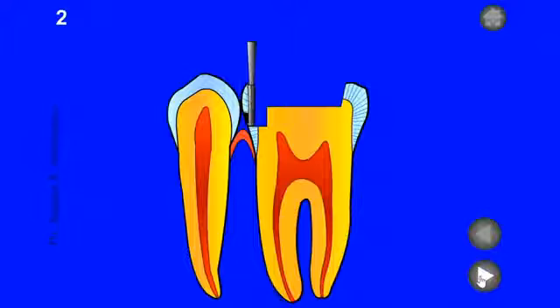Step 3. Remove all the remaining tooth structure mesially.